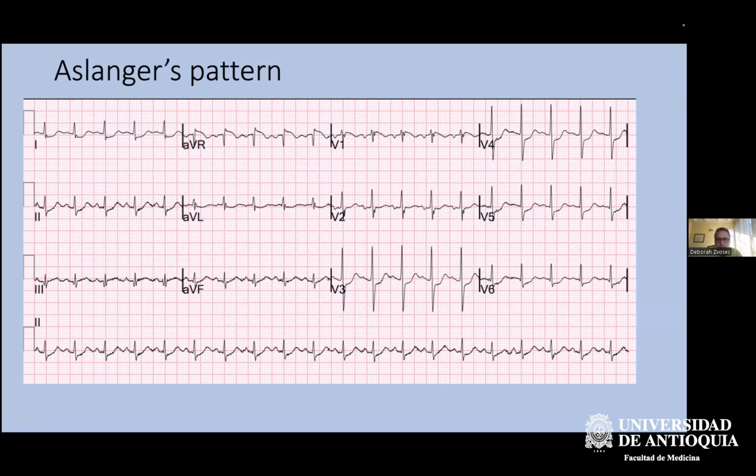Yeah, well, the system is approved in Europe. And so, as I pointed out on one of my slides, in Aalst, Belgium, they are already using it, and they're getting their non-STEMI OMI to the cath lab in 1.4 hours on average. So they are using it. It's working very well. Now, it is not yet approved in the United States. We have submitted to the FDA, and it'll be a while before we hear back. And I don't know about Colombia or any other country in South America. I don't know how that works, but anyone can use it on a trial basis.